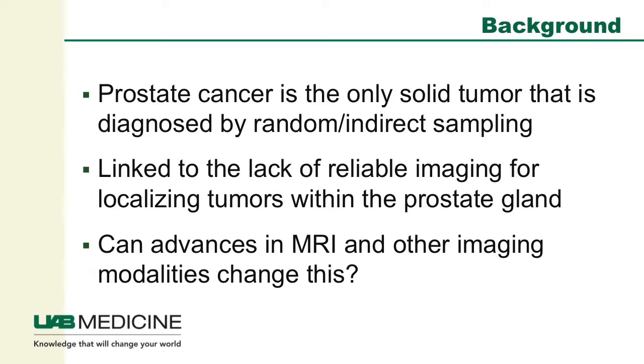Today we'll be talking to you about prostate MRI ultrasound fusion-guided biopsies. Prostate cancer is the only solid tumor that is diagnosed by random or indirect sampling. This is largely linked to the lack of reliable imaging for localizing tumors within the prostate gland. So we move forward by asking whether advances in MRI and other imaging modalities can change this approach.